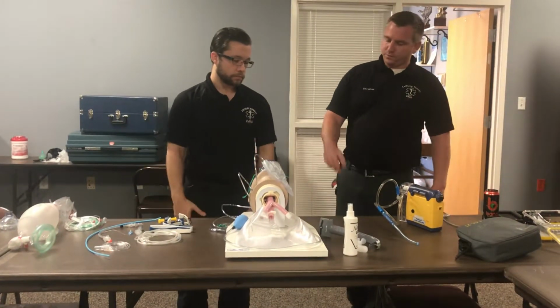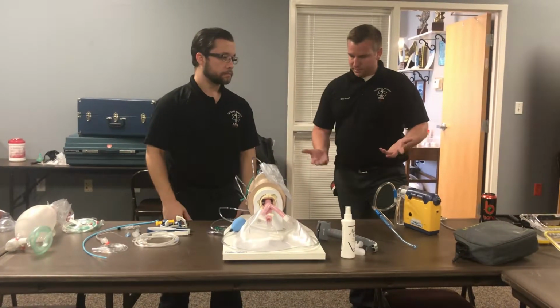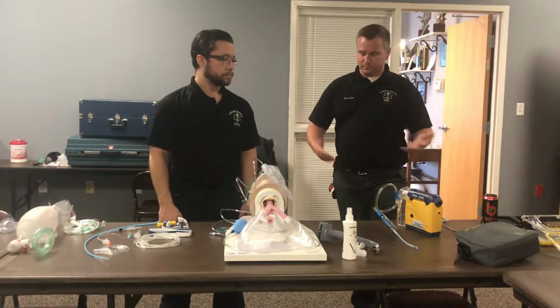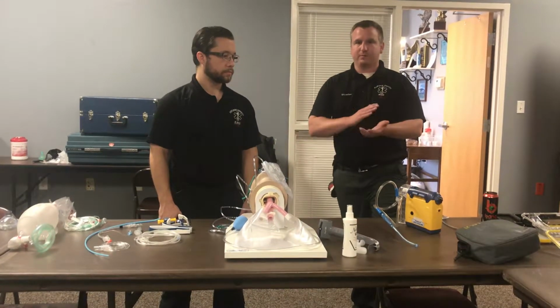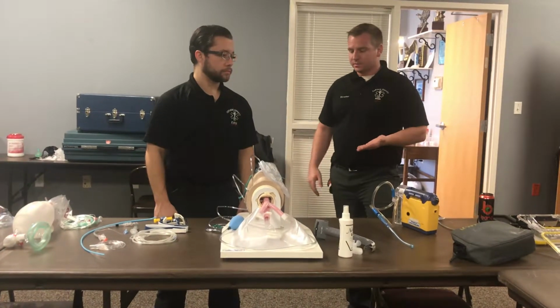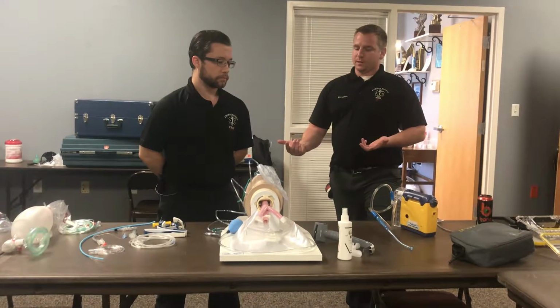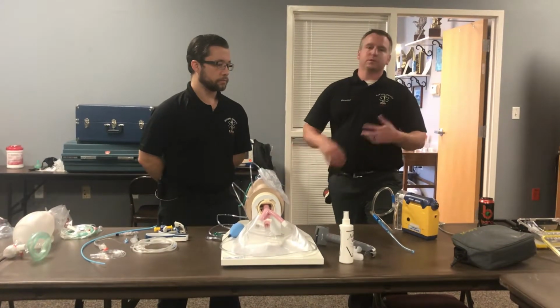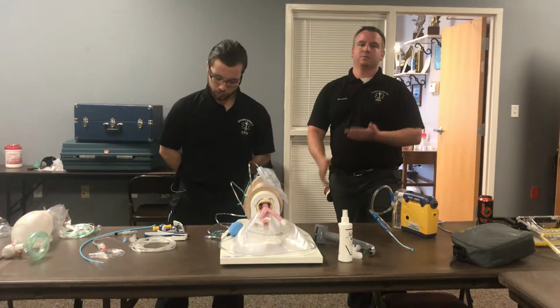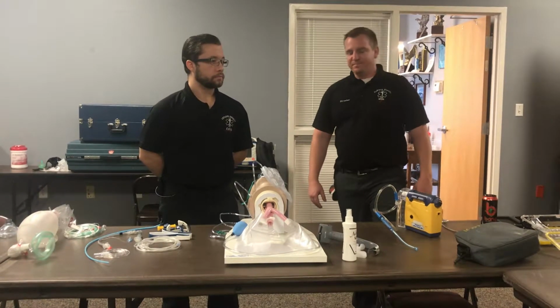Alright, so high flow O2, the patient does have a respiratory drive at this time. Levi has now decided that, fast forward, he's gone through his complete assessment and diagnostics, and the patient does need to be RSI'd. Maybe Levi had moved to CPAP and that was unsuccessful, or the condition is not one that you would typically CPAP. Whatever the case may be, we are now at the point of RSI.